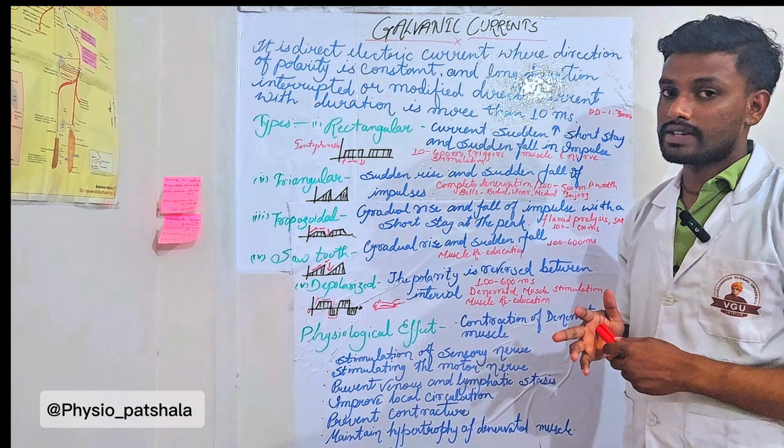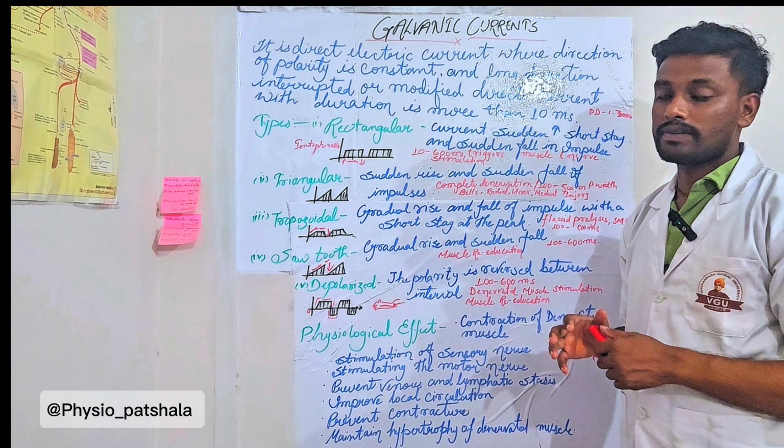So that is the physiological effect you will see in the patient. That is the first part of the galvanic current.